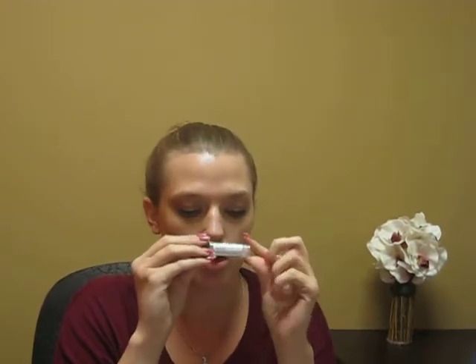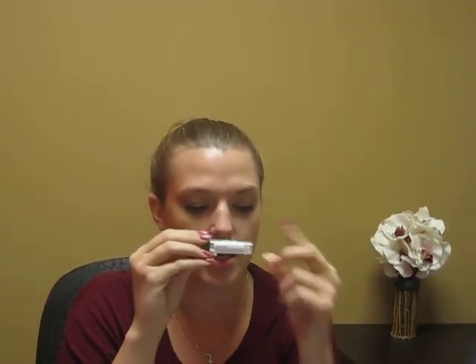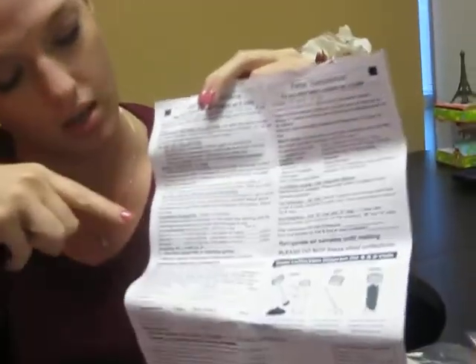There is a green one, and I'm going to go over this one. It says on the back of the saliva test right here that I was stating earlier, FL pour off vial, which is this green one. So what you're going to do here is it states pour off enough saliva from the noon or afternoon one, which are the blue vials is what they are talking about. And it doesn't matter which one, you could do noon or afternoon.